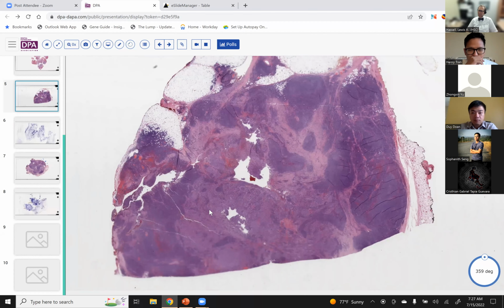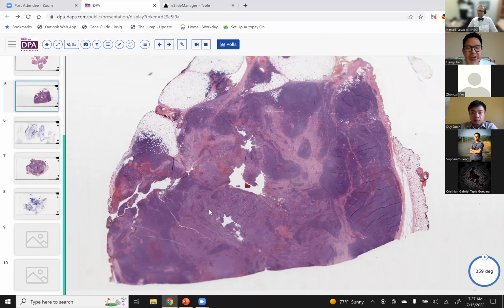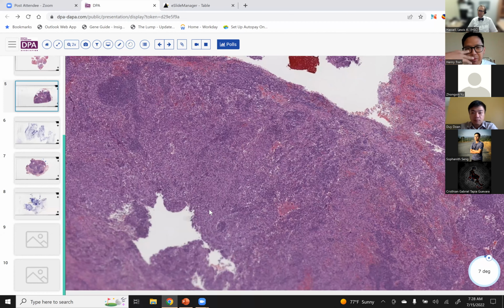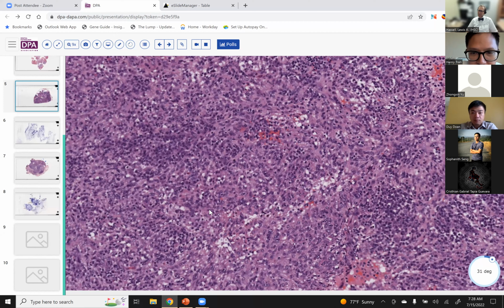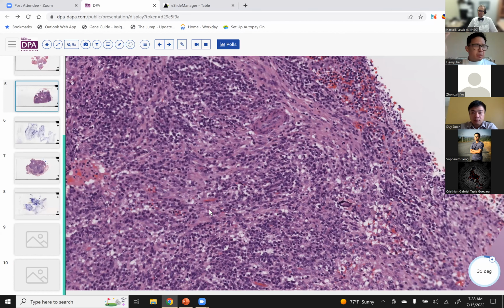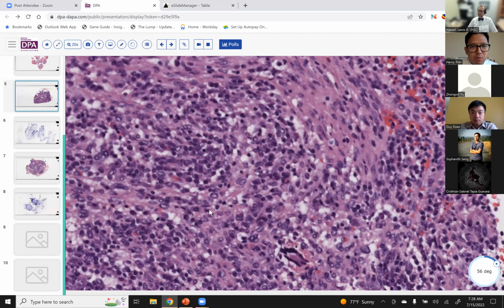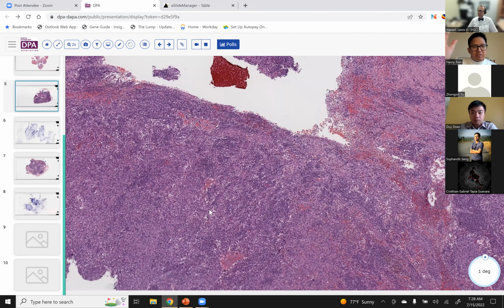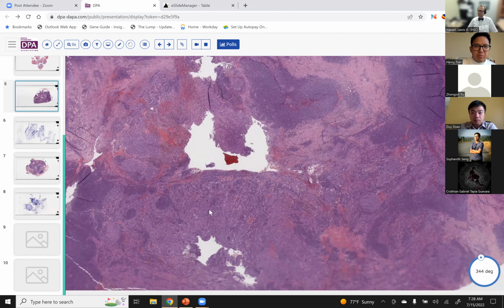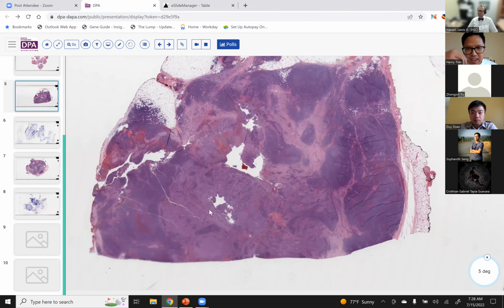This is where you have to have some experience and recognize the histologic features of this tumor. But before I go there, one thing that I also did was, we have a spindle cell proliferation with a lot of inflammatory cells, so one thing to worry about is an inflammatory myofibroblastic tumor. That can be easily diagnosed with an ALK protein immunohistochemistry stain. So we did that, and at this point we had a lot of negative IHC markers, so now we have to rely a little more on histology to figure this case out.